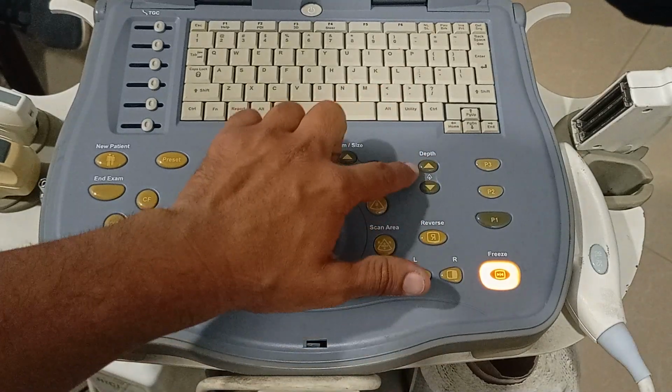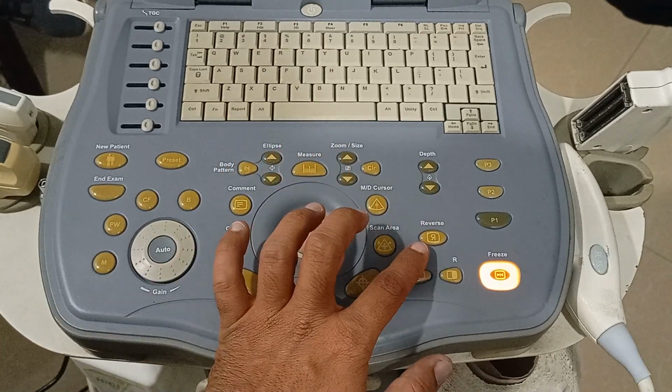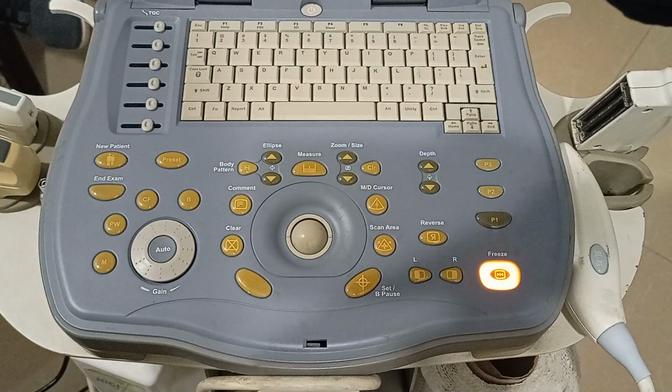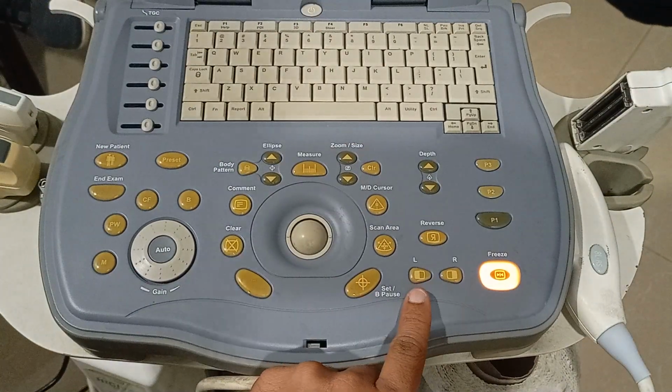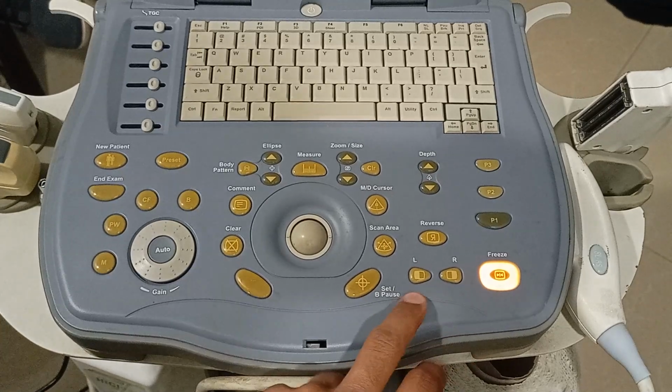Then this is for depth, so you can increase or decrease the depth. Then this is for the reversal of the image. When you press this R, the image is flipped from right to left. And similarly, you can screen two structures at the same time. You can compare the right side with the left side very easily.